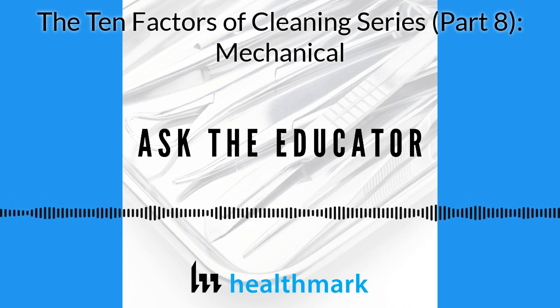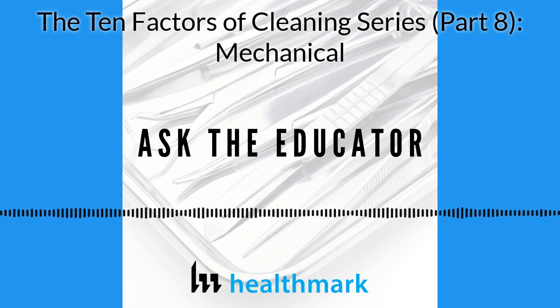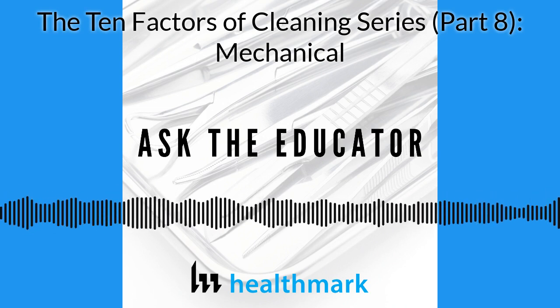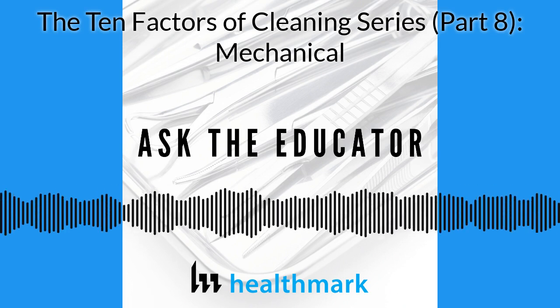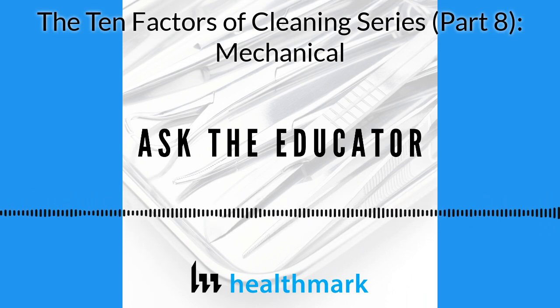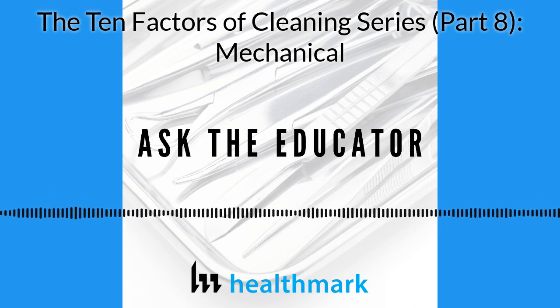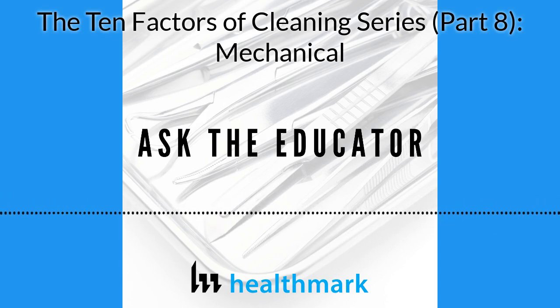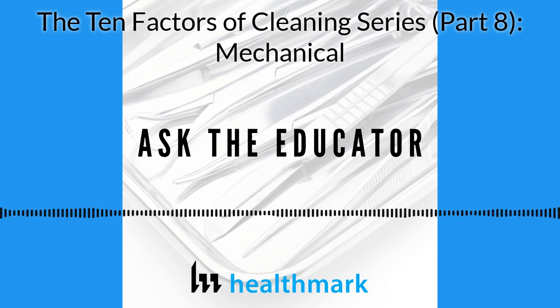Even 15 years ago, a sonic could do instruments, flat instruments, robotic arms, and lumens, but you're buying it first for that cavitation. And you want to make sure you're getting cavitation. If you have that, then it's going to do what it's supposed to. The next one is that pulse flow or retro flow, and you want to make sure the pump's working.